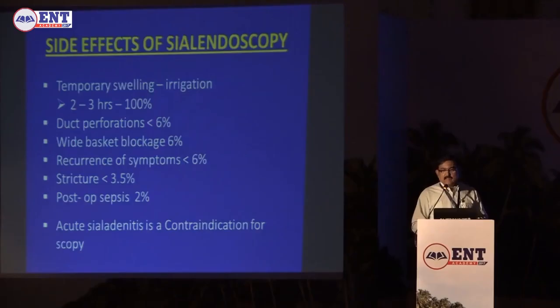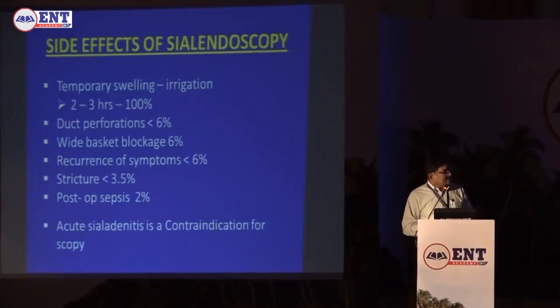So what are the bad effects? Temporary swelling. Generally, we don't even admit, they come in the morning and they leave in the evening. It's a daycare procedure. Sometimes you have this basket blockage and things like that, but there is no major complication. In double approach, if you cut the lingual nerve, it's a problem.